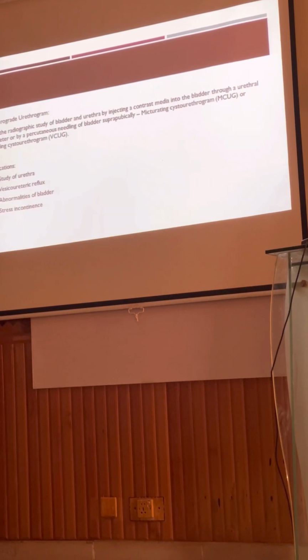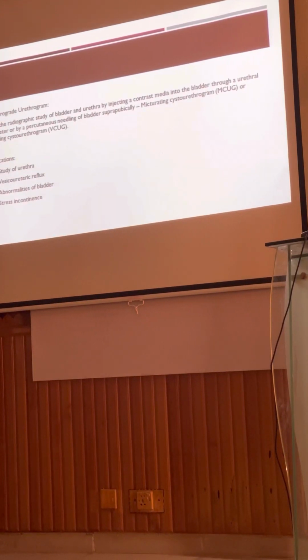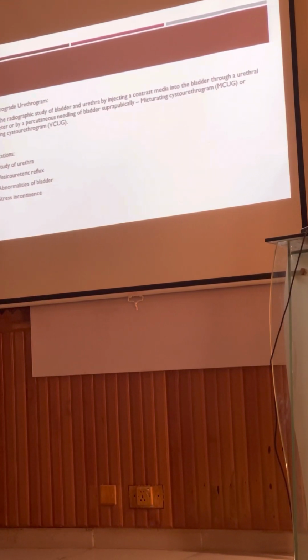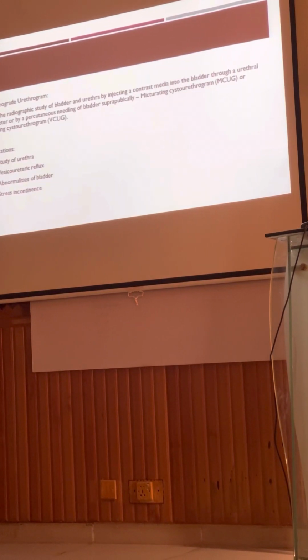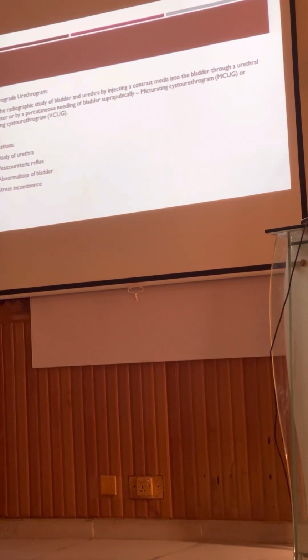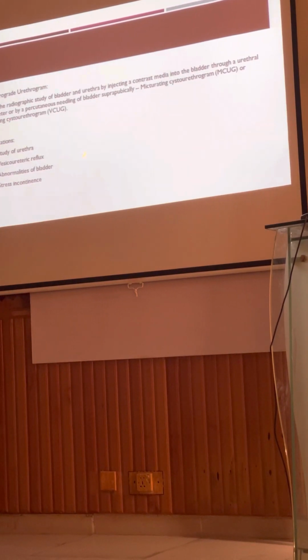Now the indication of this investigation is if we want to study the urethra, and if we want to study the bladder, abnormalities of the bladder, if you want to know anything about vesicoureteric reflux and stress incontinence, the cystourethrogram is an important investigation that should be performed in these cases.